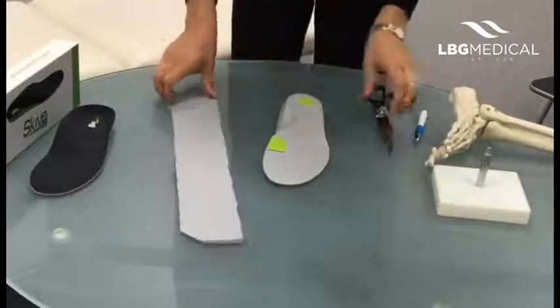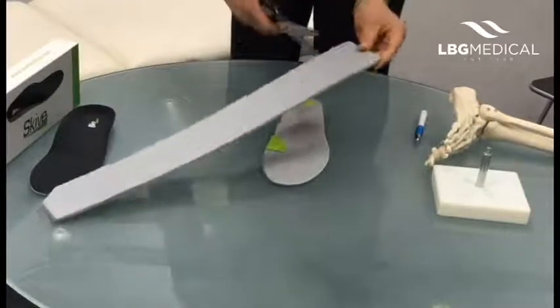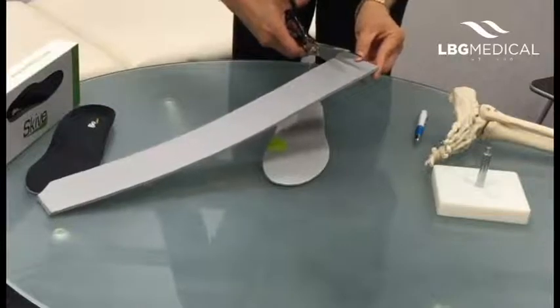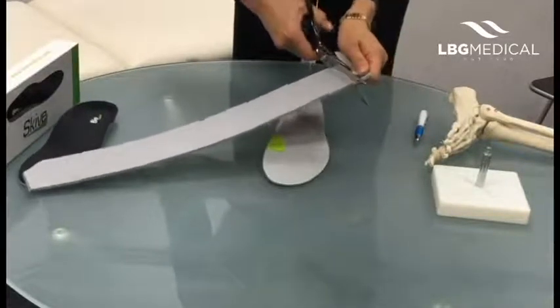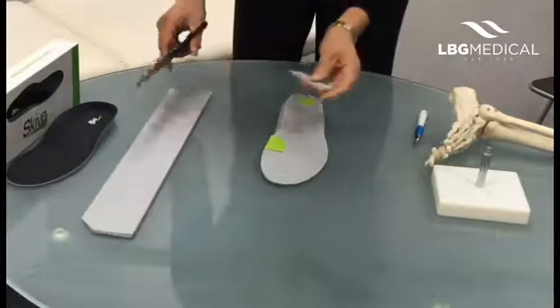This is a very quick and easy adaptation to do. I've just got a long strip of 3.5-degree posting. Could use 5 degrees but we'll start with the smaller one. I'm just cutting a small strip off — you probably want that about the same width as your patient's big toe.